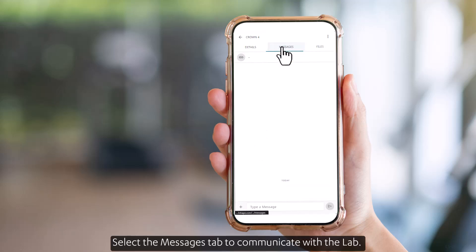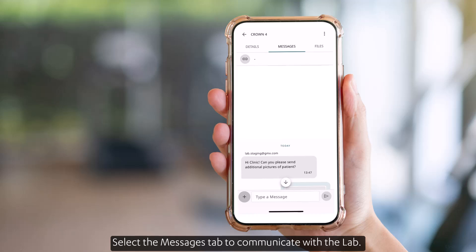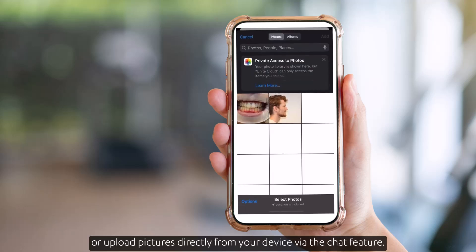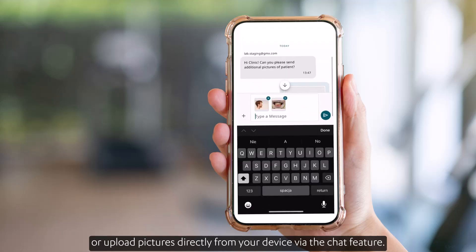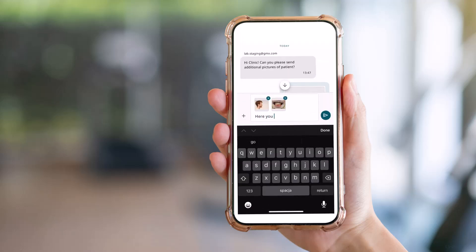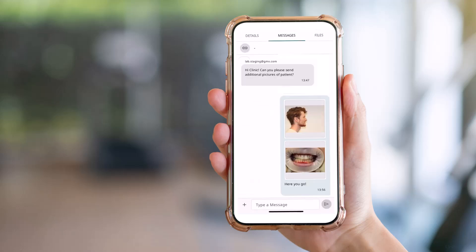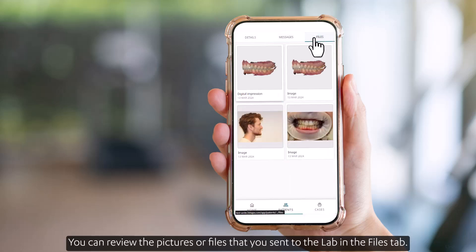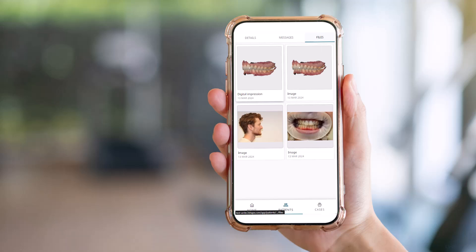Select the Messages tab to communicate with the lab, get updates on the case status, or upload pictures directly from your device via the chat feature. You can review the pictures or files that you sent to the lab in the Files tab.